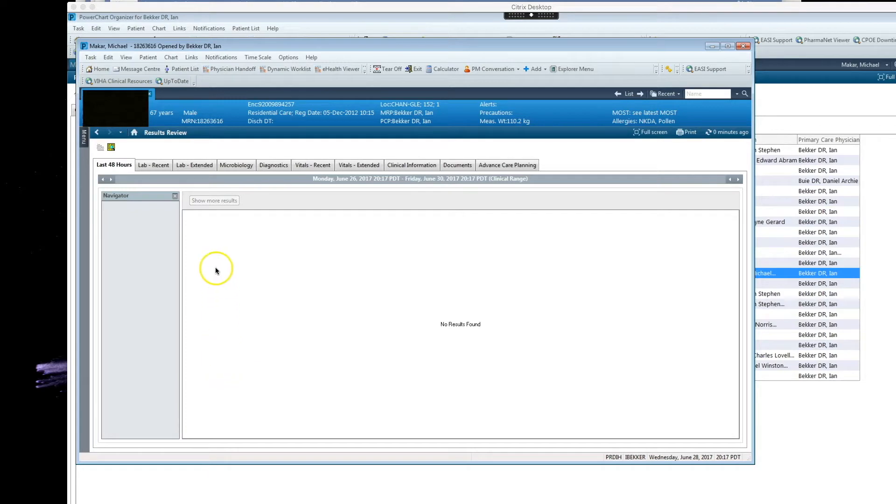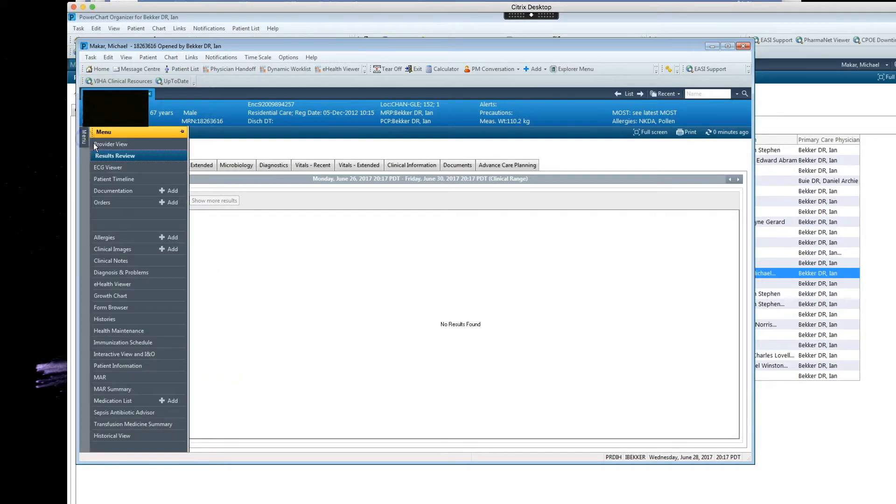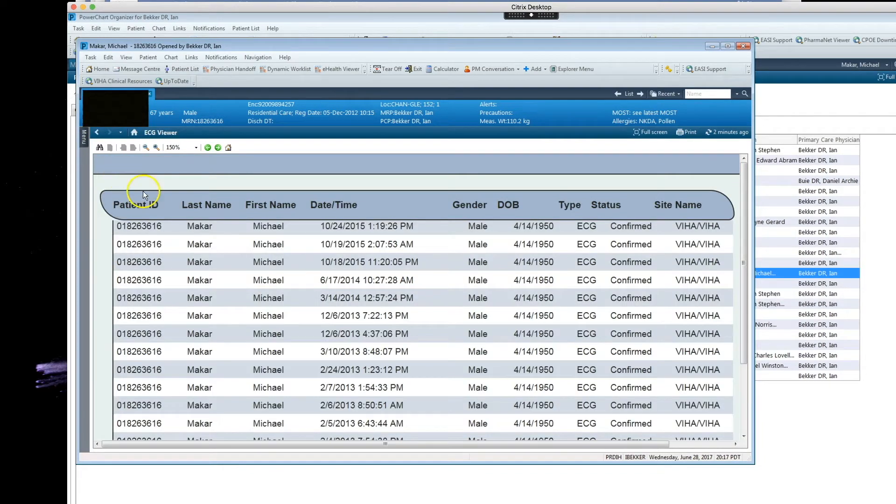So here I am in my patient's chart and finding ECGs is as easy as going to the menu and hitting ECG Viewer. And there they are.